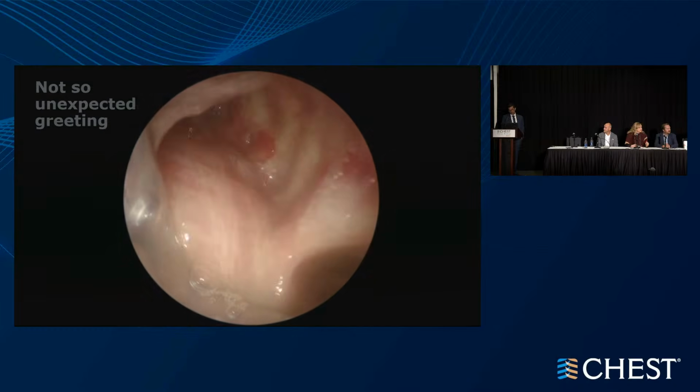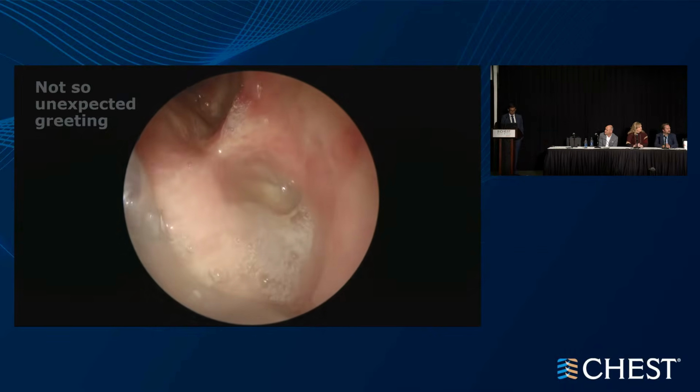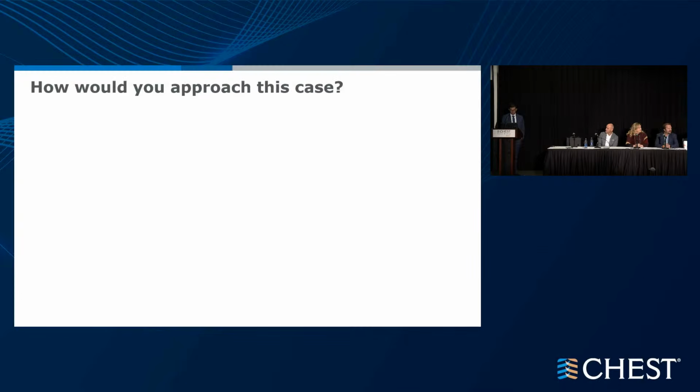All right, so this was our first view in. Just a quick peek down there, and then this little guy. More of a big guy, but. And so that was just the first view. And so just like you said, debulking and trying to really open something up and get a lay of the land in there, because that's kind of terrifying, and we see clinically it's obviously impacting him. Would anyone do radiation first?